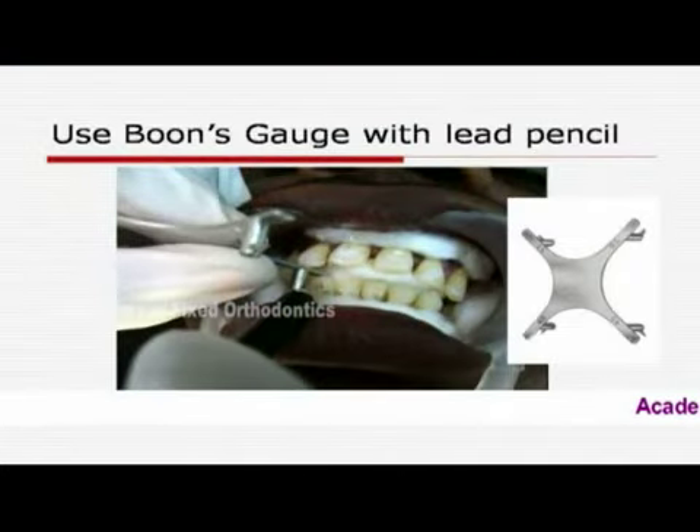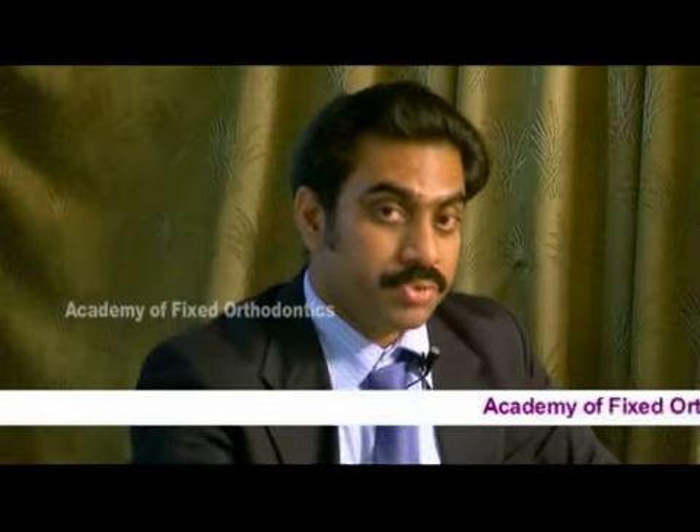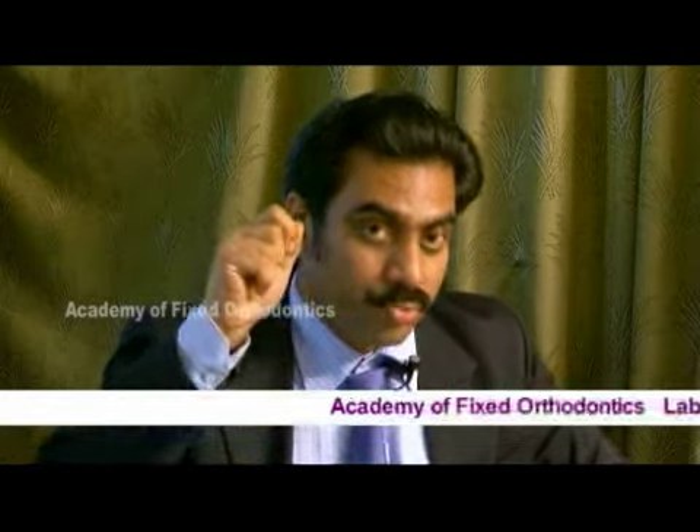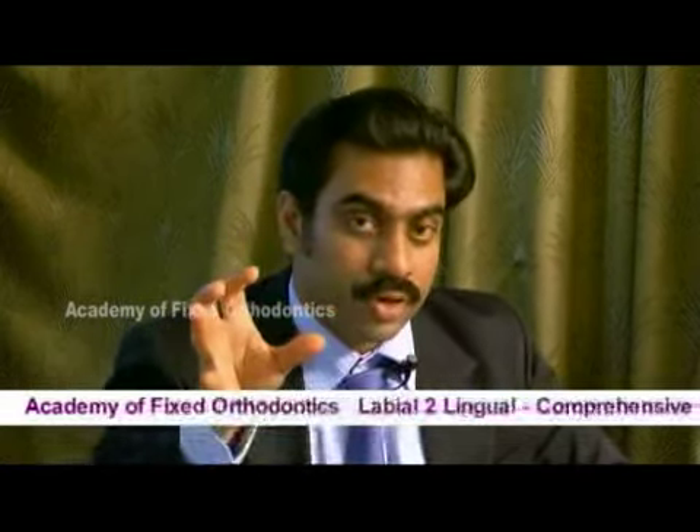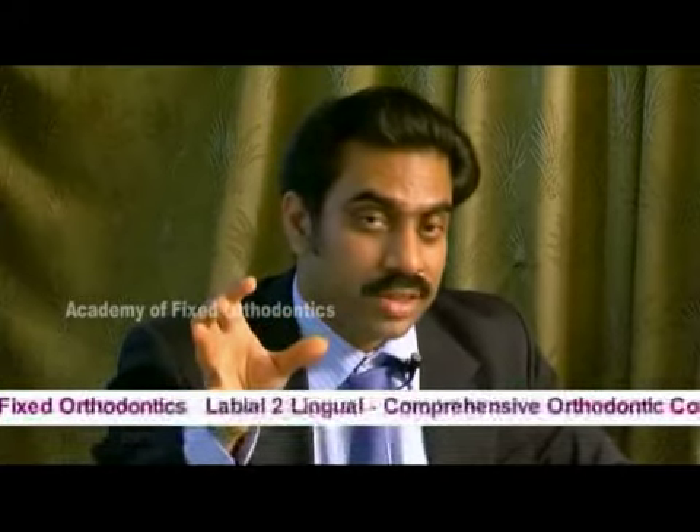In both cases you can use a lead pencil to mark. Just be careful that you don't press too hard with the lead pencil, or this mark will remain and it won't go off even if you polish the tooth well.